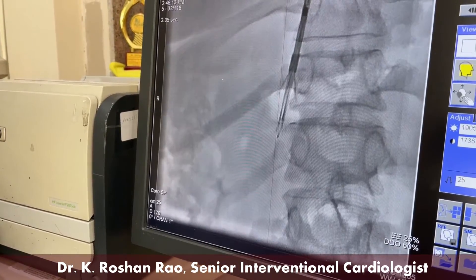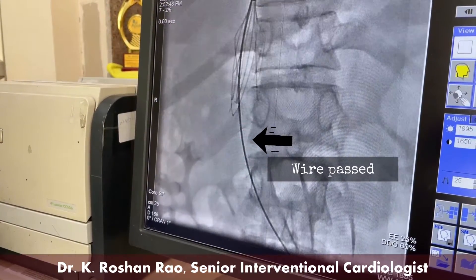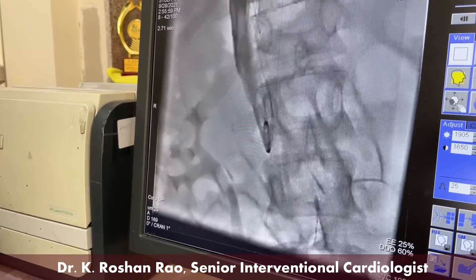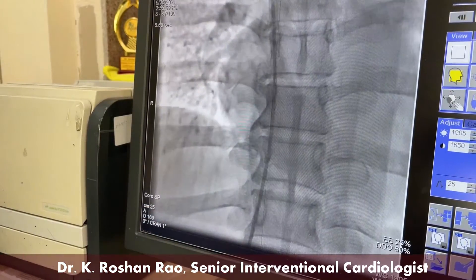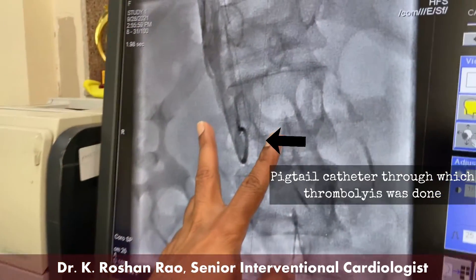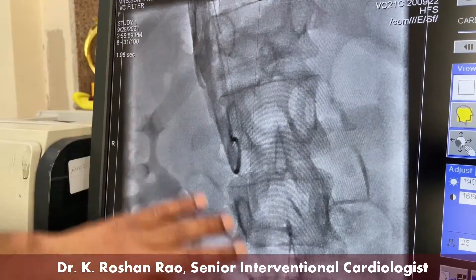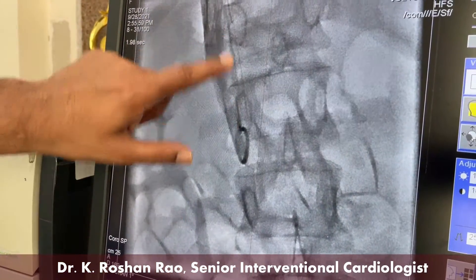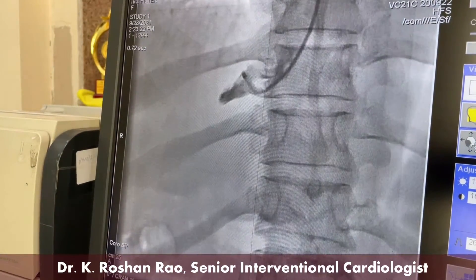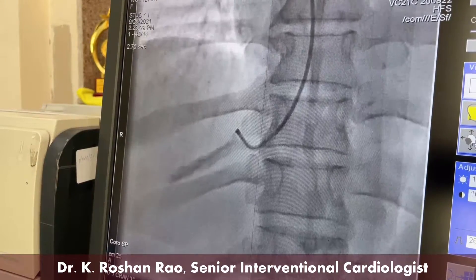We implanted the IVC filter just beneath the hepatic vein, then passed a wire across and placed a pigtail. If you can see the haziness, there is hardly any flow — it should be this big here, but it is constricted, meaning the entire wall is loaded with thrombus. The radiolucent area is also thrombus, indicating a very large thrombus burden.